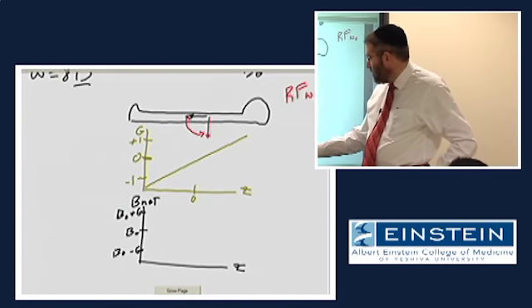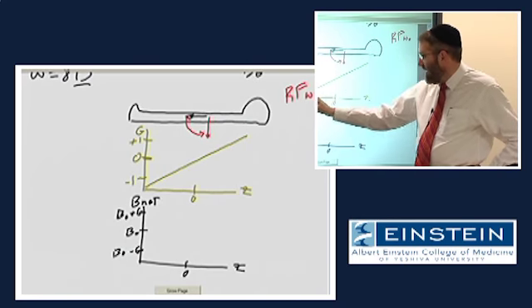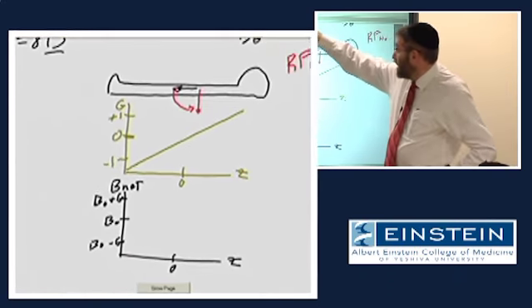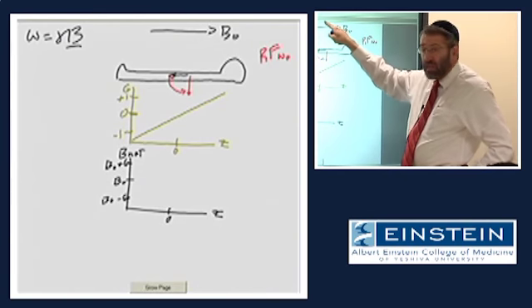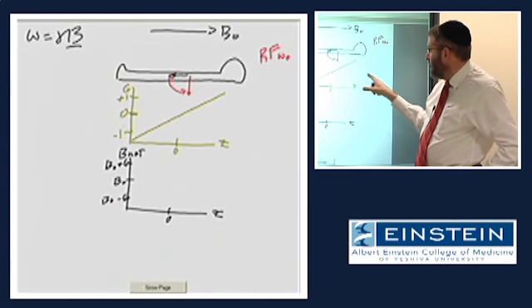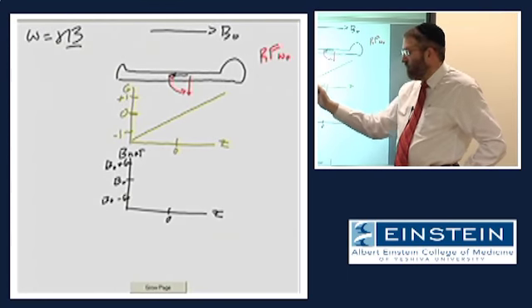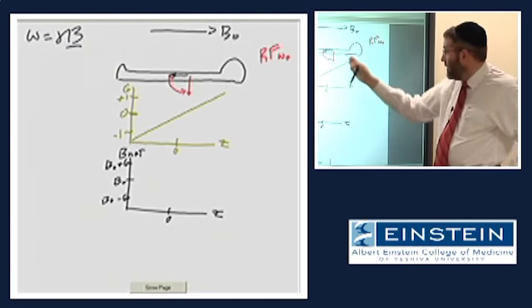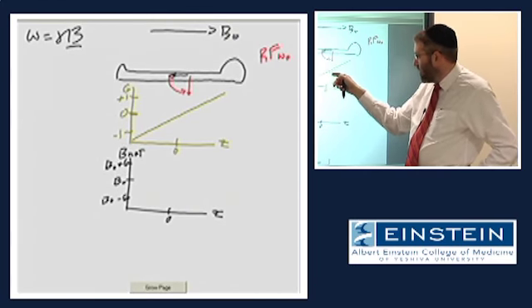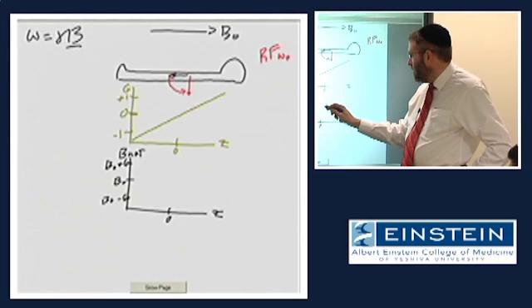At isocenter, the gradient magnetic field strength is 0. The net magnetic field strength is the sum of all of the magnetic fields that are present in the scanner, which include our static magnetic field strength that is homogeneous all the way from left to right, and whatever gradient magnetic field strength might be present. Of course, the strength of the gradient magnetic field varies depending on location. At isocenter, there is 0 gradient magnetic field strength, so the net magnetic field strength is simply B naught.